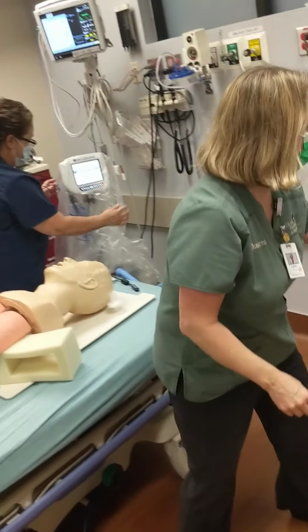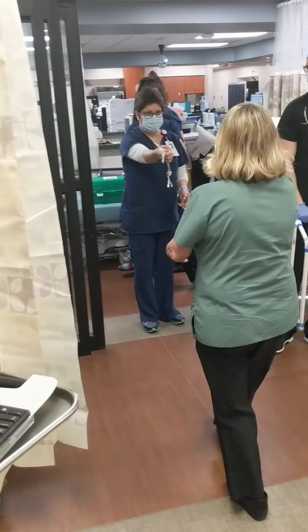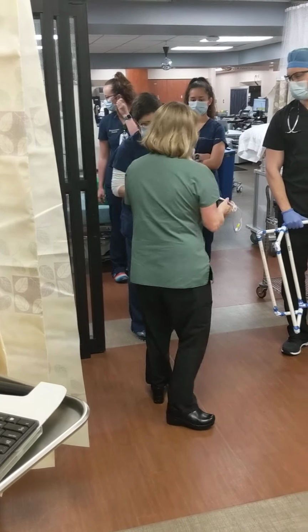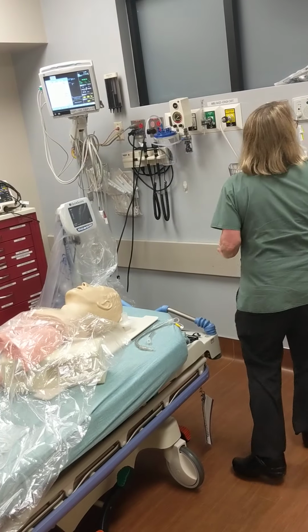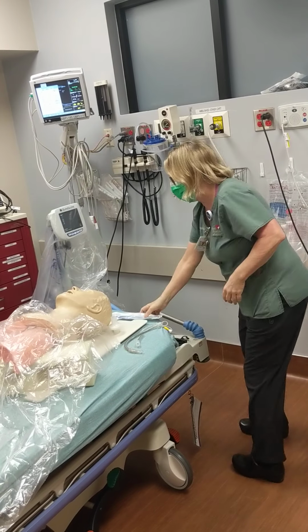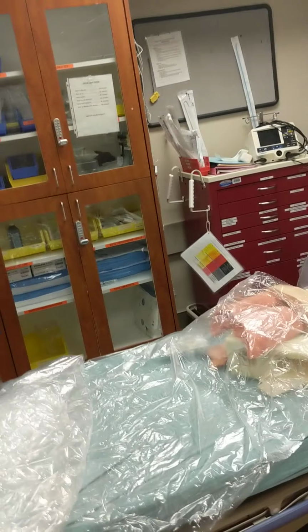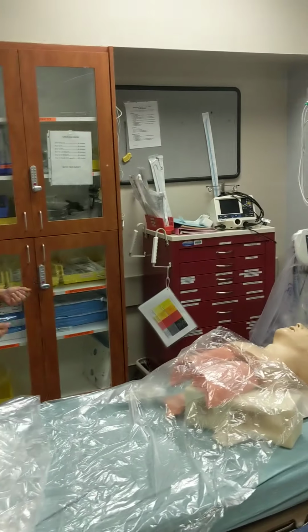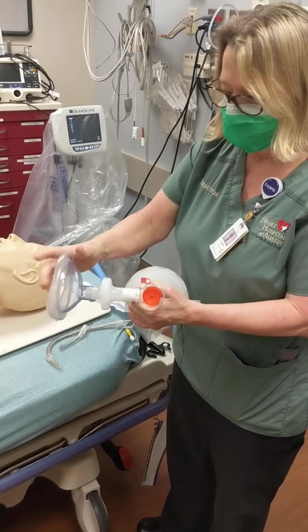And then my respiratory therapist has my ET tube. So I have my ET tube ready. I have my suction ready to go. I'm going to get my ambu bag. The nurse is getting her RSI box. Cover the RSI box. Can I have the RSI box? Thank you. On my ambu bag, I'm going to put my HEPA filter, or a white filter. This is bacterial and viral also. So I'm ready to go.